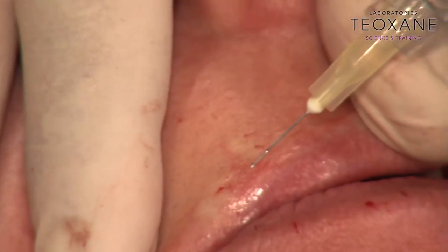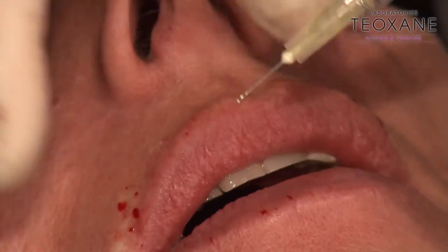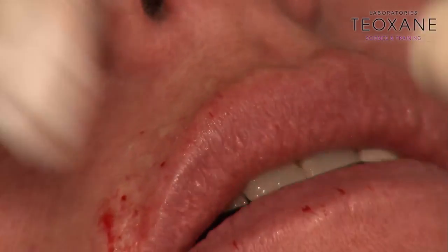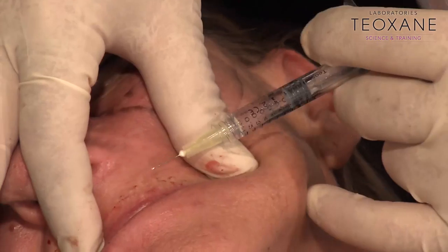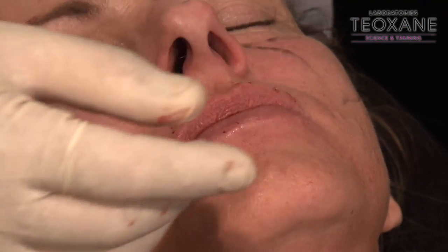We had a dent on the upper lip. I'm going to try to fill it, to lift the area. Sometimes I have to lift the area. Okay. I'm rejuvenating this upper lip area very superficially by a blanching technique, all the micro dents, the micro lines. You will see when I spread with my finger after, the whole thing is going to be great. Voilà. It's an epidermic injection, very superficial. Wet? Yes.